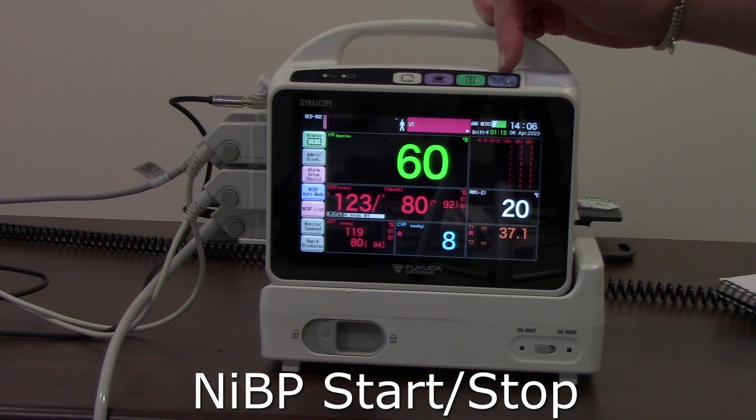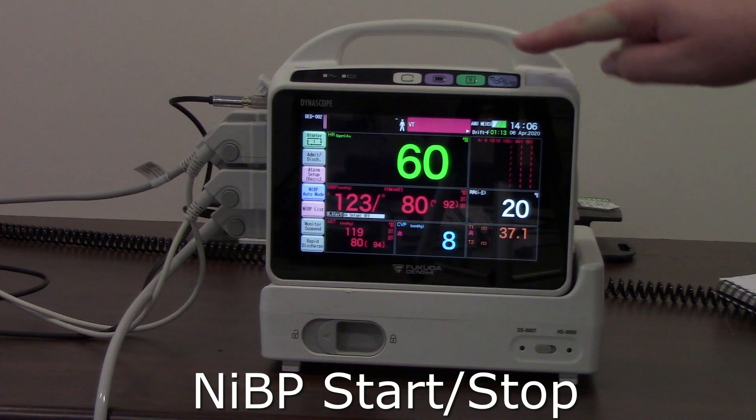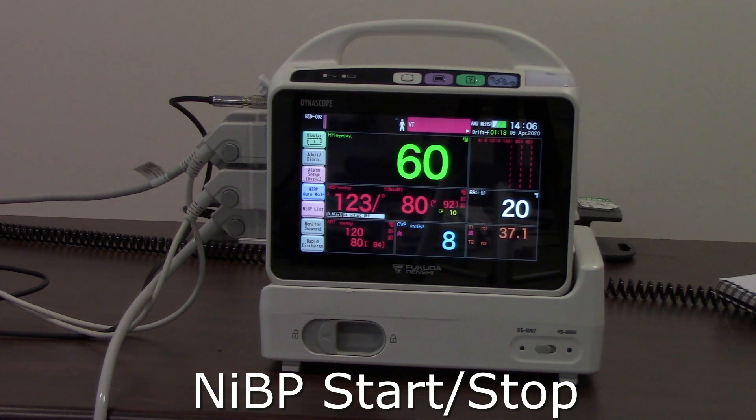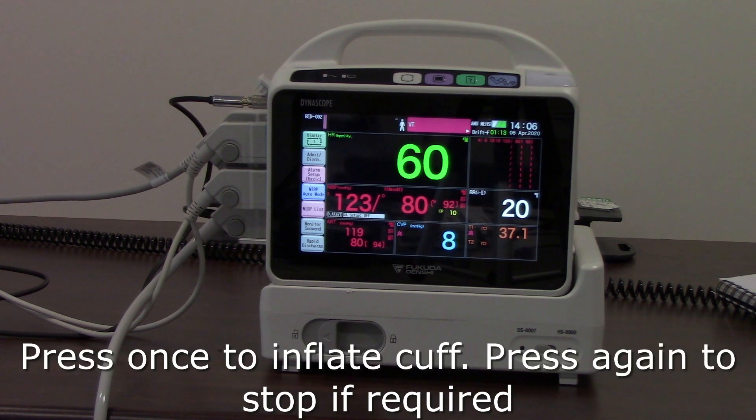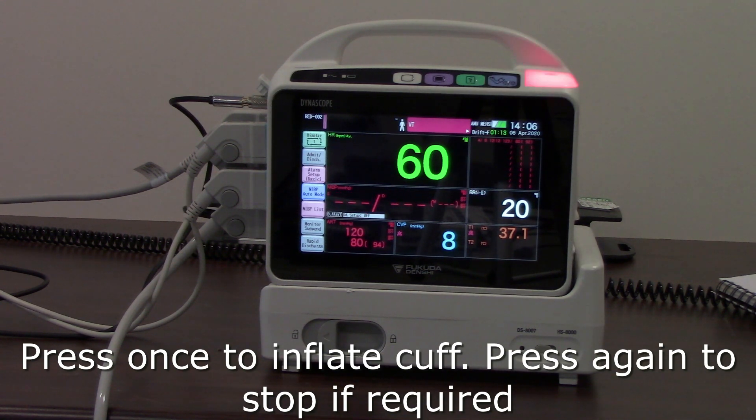Moving along, the next key is the non-invasive blood pressure start/stop button. When you press that button you'll hear it inflating the blood pressure cuff. If you need to stop it, just press again and it will stop the NIBP cuff from inflating and stop the measurement.